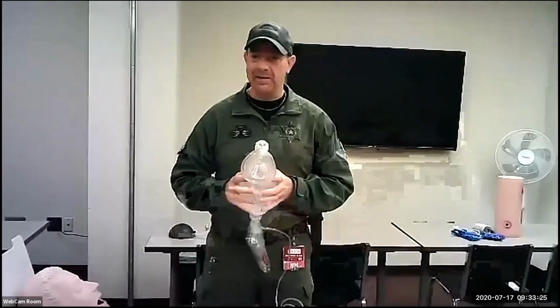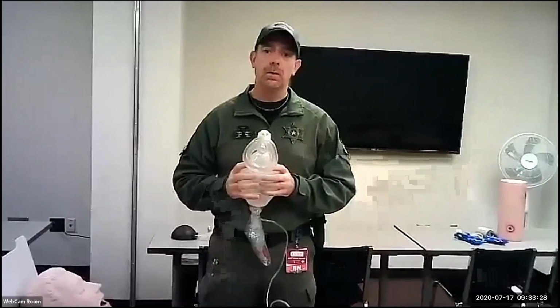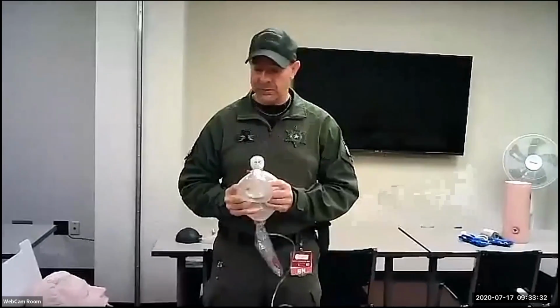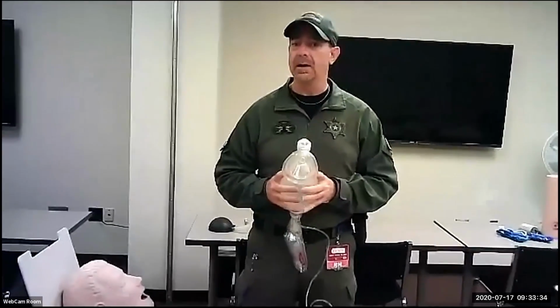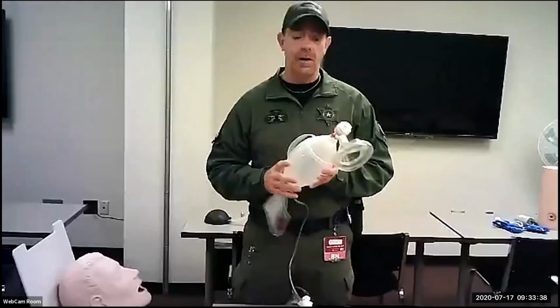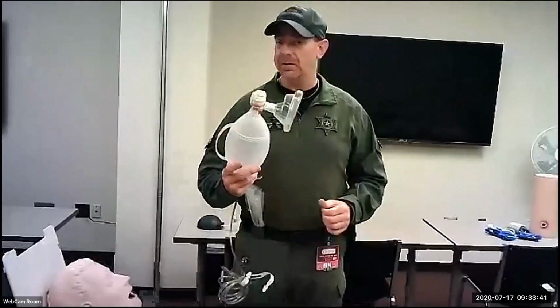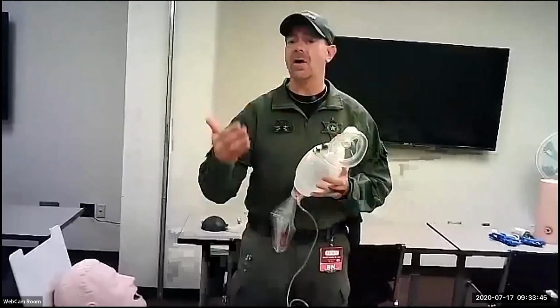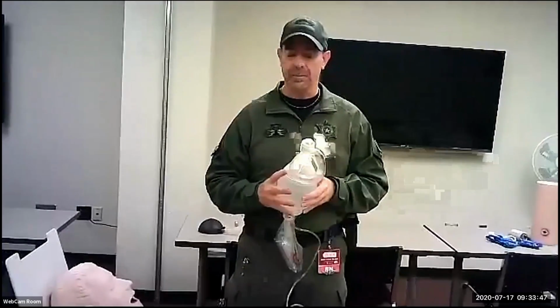When you're bagging people, when you're breathing for them, we're not spazzing out. It's slow, one breath every 3 to 4 seconds, all right? And I promise you, when you do this, you're going to be really nervous. You're going to hyperventilate. You can actually cause barotrauma. You can damage your lungs by doing this too much. I can tell you on the SWAT team, we're getting rid of the adult size and going to pediatric because they're getting enough oxygen, it's fine, and we're not going to damage people.